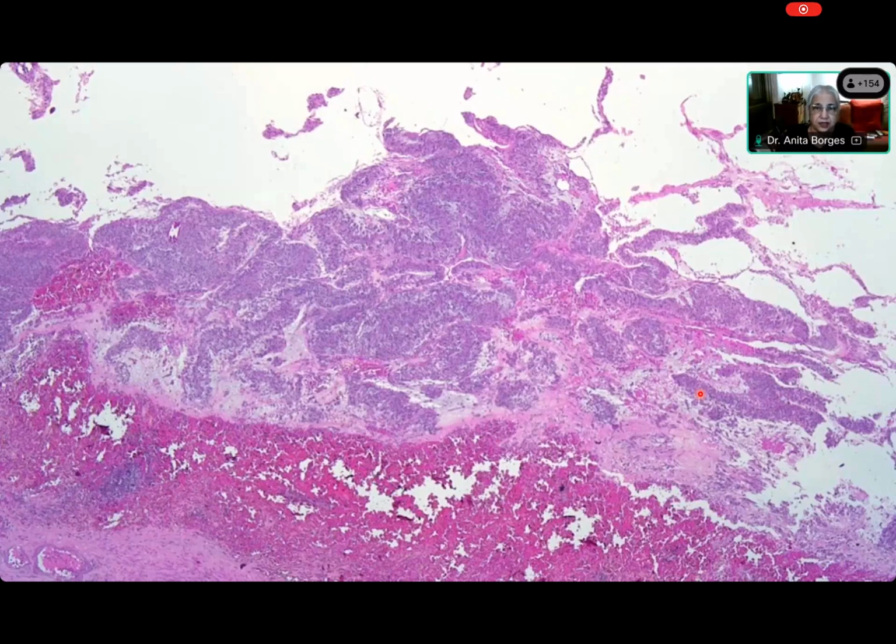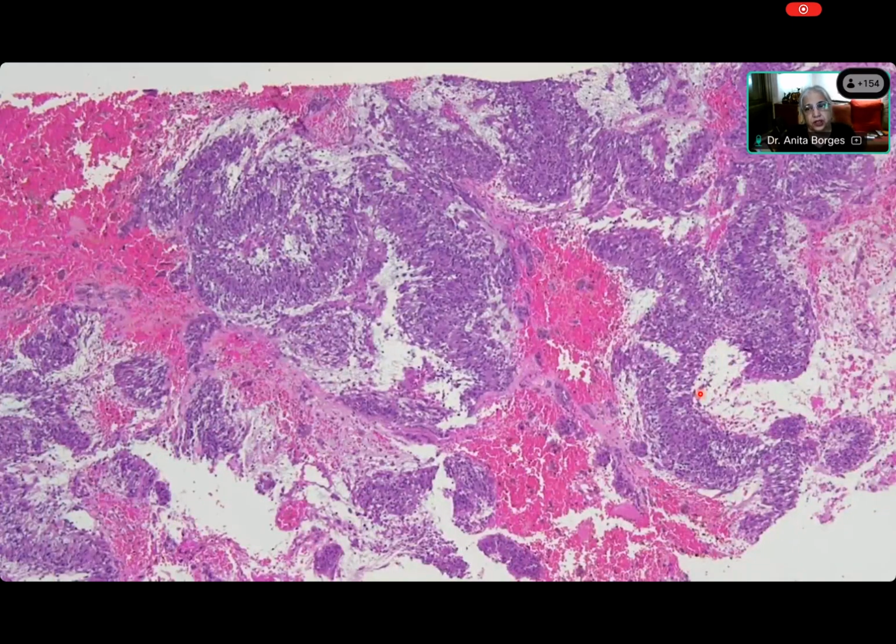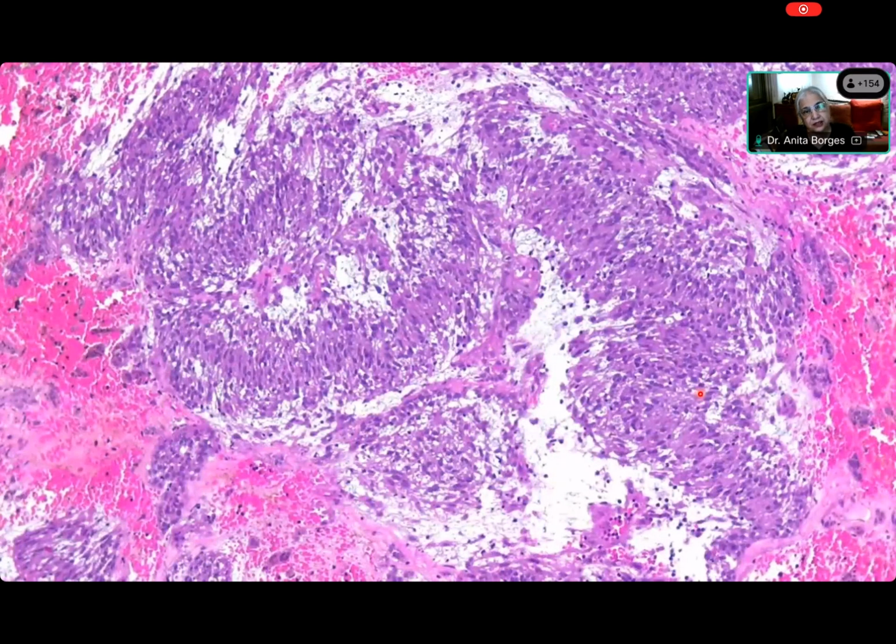Okay. So, is it something like what you see in the ovary when you see a cystadenoma or a cystadenocarcinoma? Is it that kind of cystic change or what? Ma'am, solid with a cystic degeneration. Okay. Now we come to cystic degeneration. All right. Come on. What are you seeing here now? This is the solid area, right? Yes, ma'am. Palisading. Very good. Yes, Diksha. What are you seeing? Palisading of tumor cells.